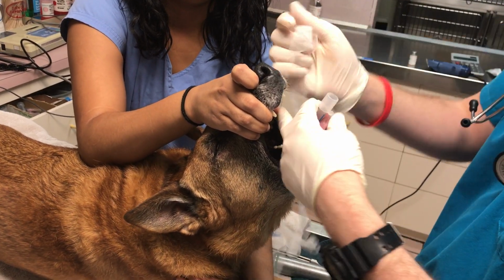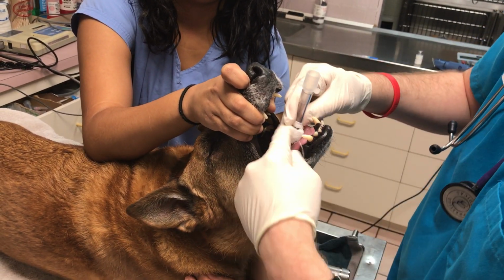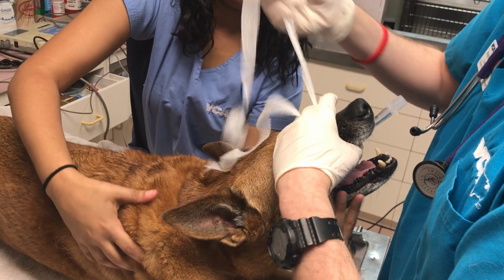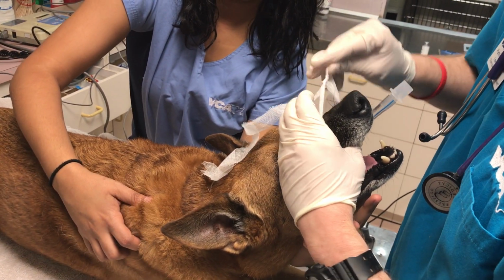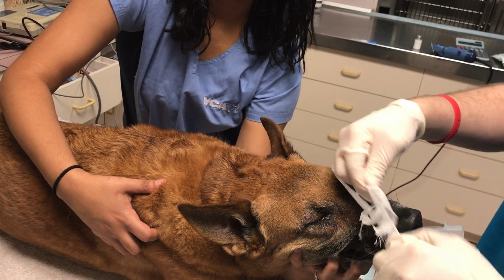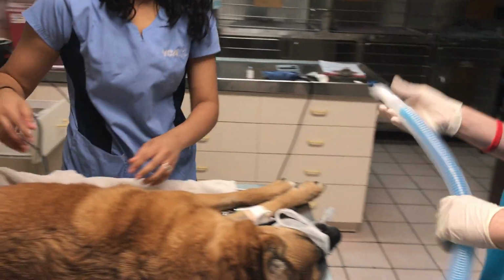Next, I'm going to use some gauze. This will help secure it. I'm going to go on top of the mouth. Now, next, what I'm going to do, I'm just going to rotate it to the side right here. I'm going to attach it to the anesthetic machine.